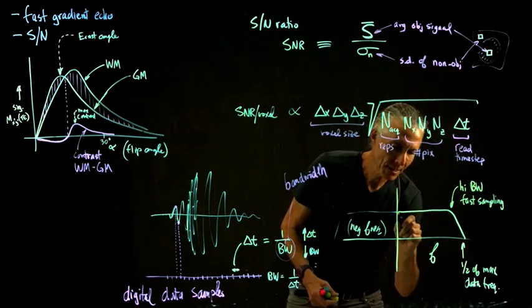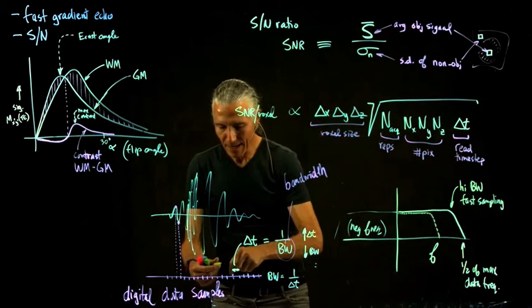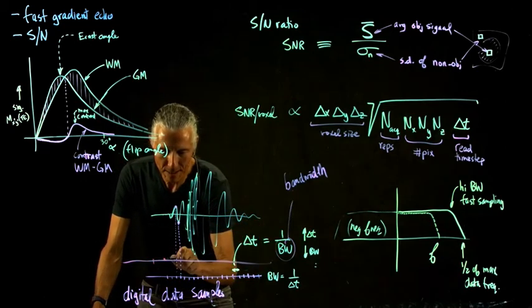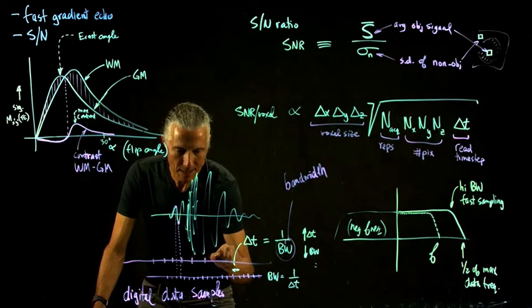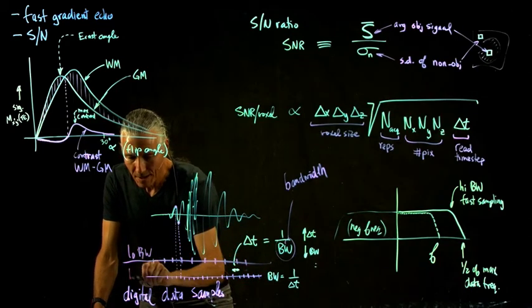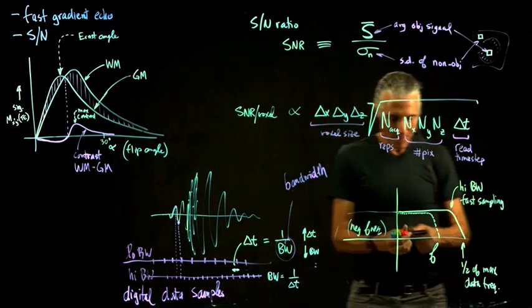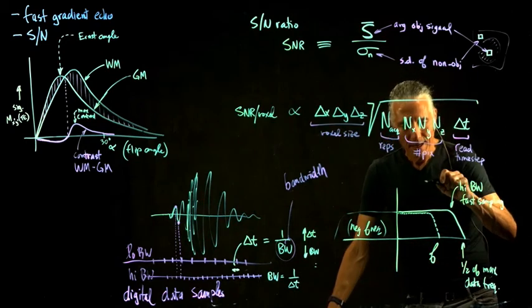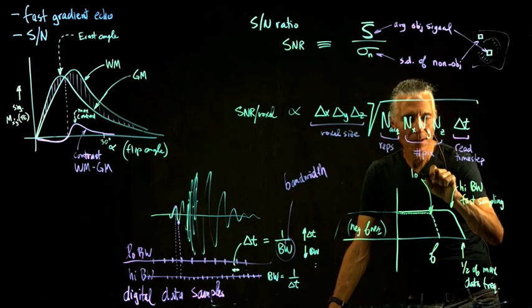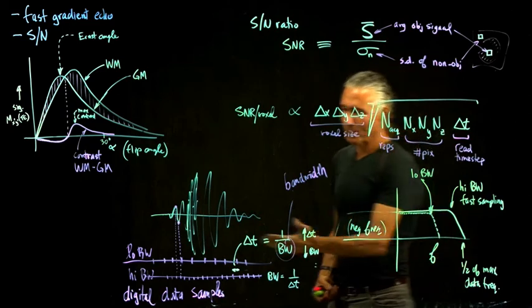If we look at a low bandwidth scan, we would record the data, spreading the recording of the data out further. So we would just sample it like this. That's low bandwidth. High bandwidth is the other. If we did that, we can move the filter down, because we no longer have to sample very rapidly.